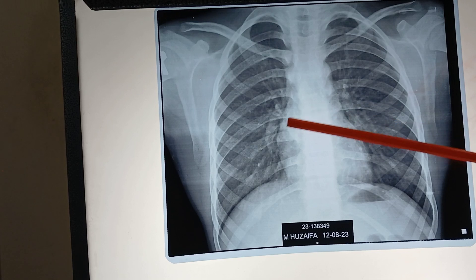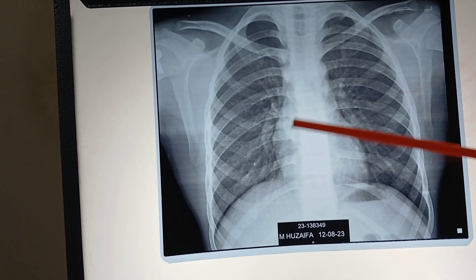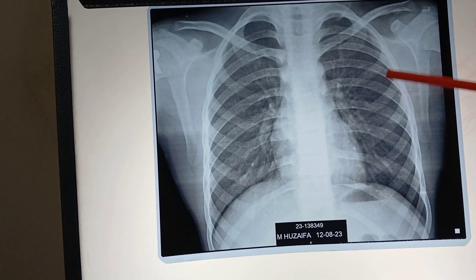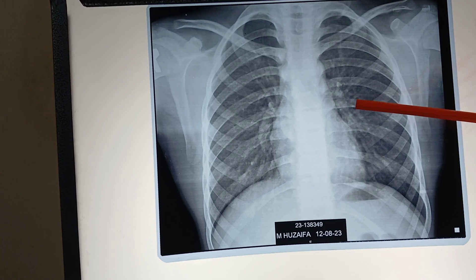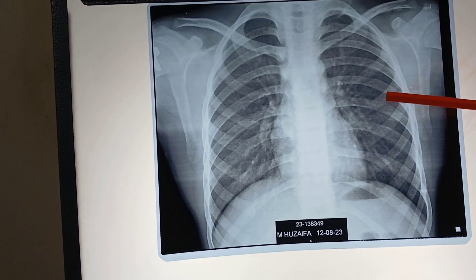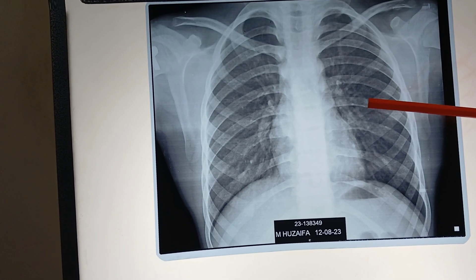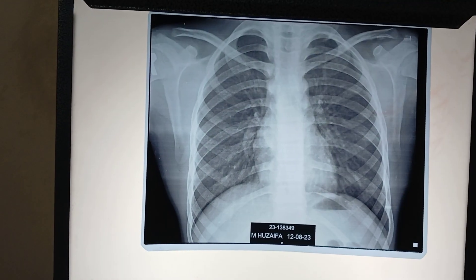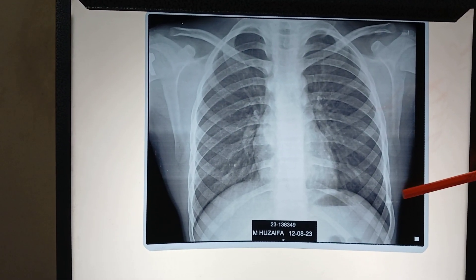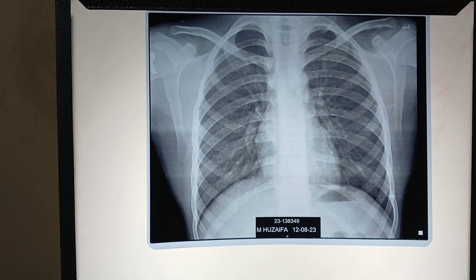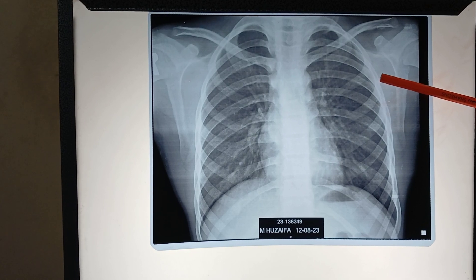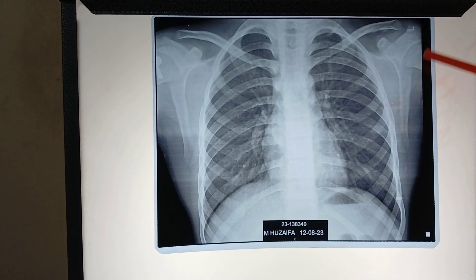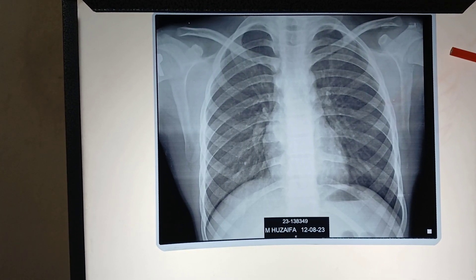These are the hila. The left hilum is higher than the right hilum. Both hila are concave laterally. If they are bulky or convex in form, then possible causes are either lymph nodes in the hilum or enlarged pulmonary arteries. Also assess the chest wall and compare both sides. The contours of the ribs should be evaluated, as well as other bones visible on X-ray such as scapula and humeral heads, to check for any fracture or bony pathology.